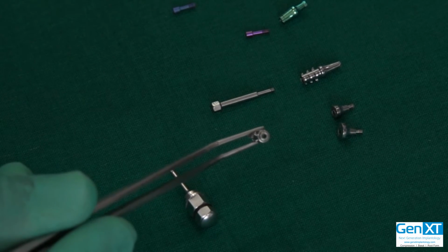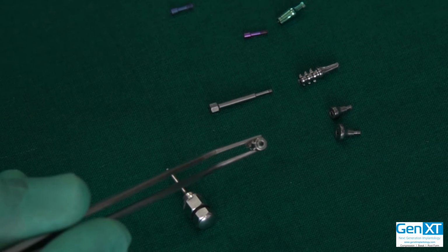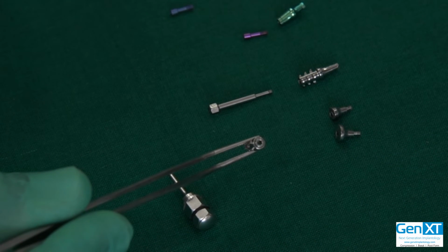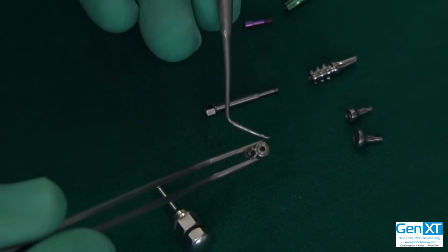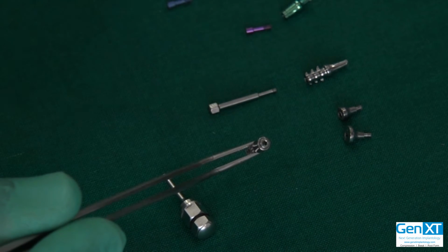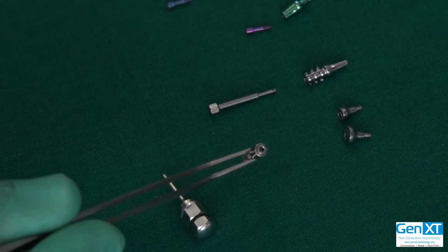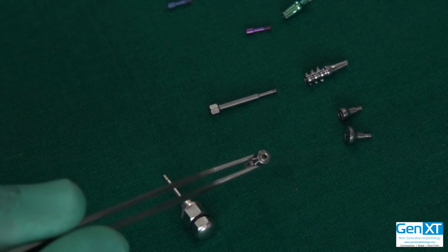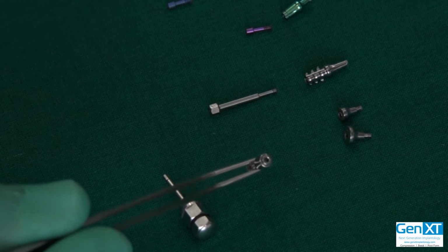What this gives us is an opportunity, because as I said, we will be placing this implant about 0.5 mm, sometimes even 1 mm subcrestal. It allows the bone to grow over the shoulder, and that's what's going to give us our platform switch design and a sort of biologic seal. And to try and avoid crestal bone loss, to maintain the crestal bone at its level, there are so many advantages to it.